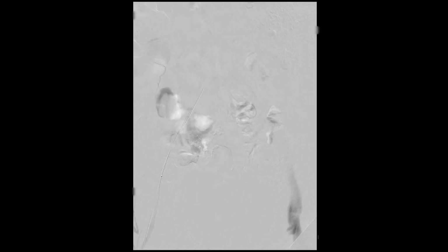I elected to start with the patient in the prone position and access both popliteal veins based on the extent of the thrombus in the legs based on the ultrasound. An argument can be made for placing a right internal jugular vein access, and we left this as a possibility for later in the case.